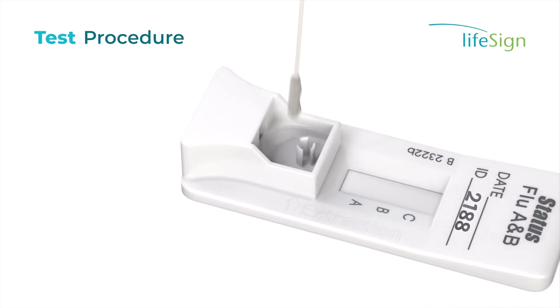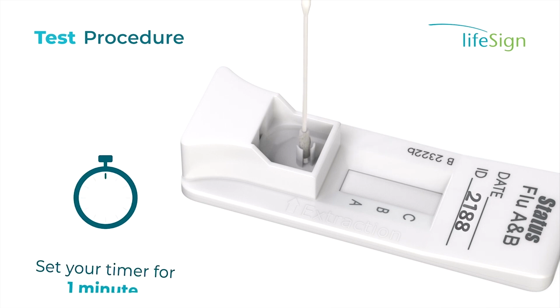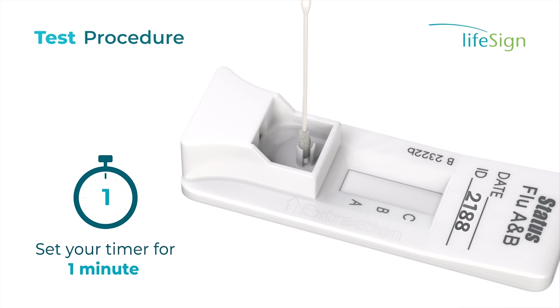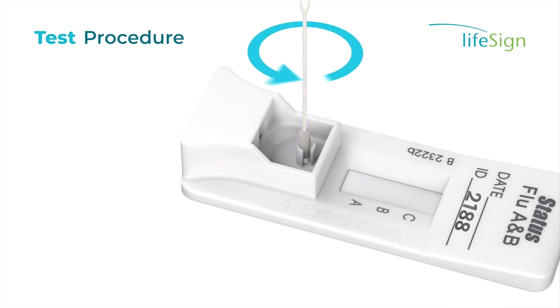Insert the patient specimen swab into the prong swab stand in the extraction well. Rotate the swab 3 times in the same direction to mix the sample. Allow the swab to stand in the device to incubate and set a timer for 1 minute. Then, rotate the swab again 3 times in the same direction. Remove and discard the swab.